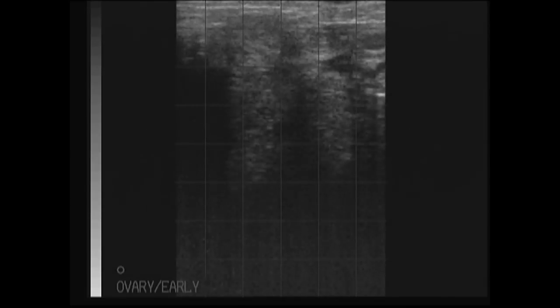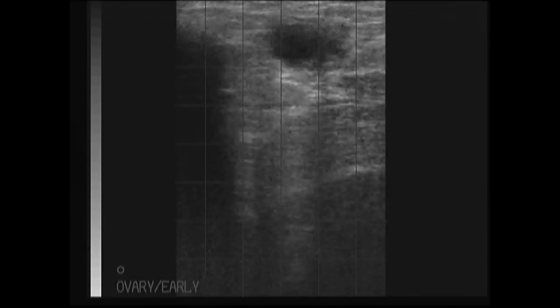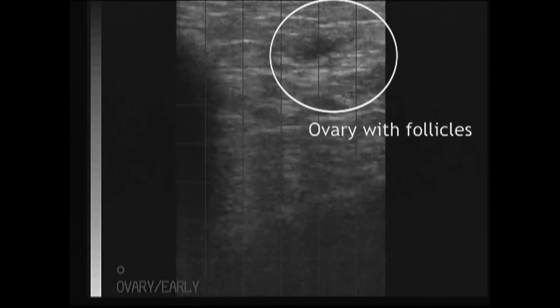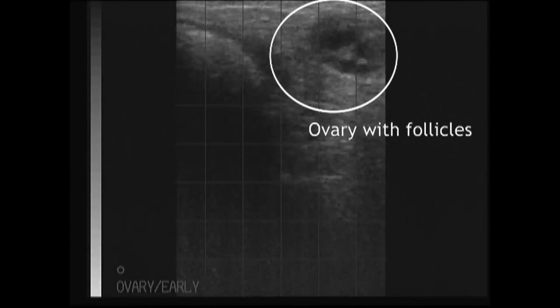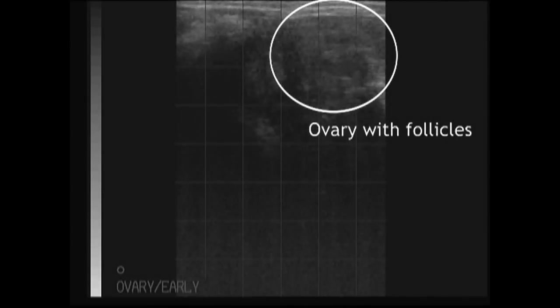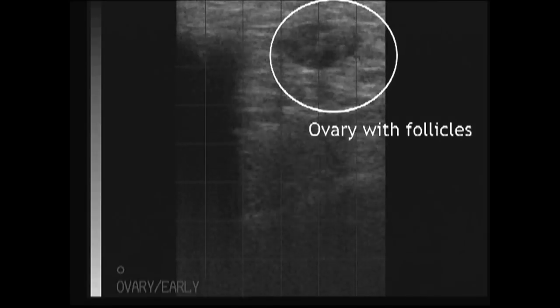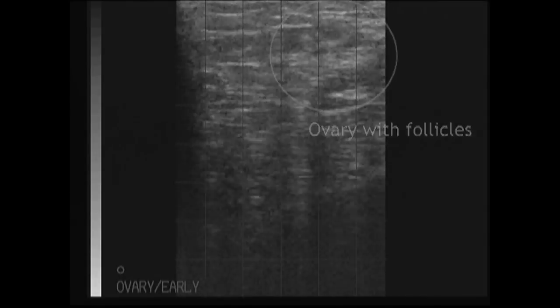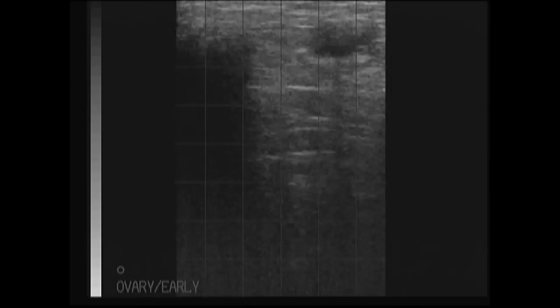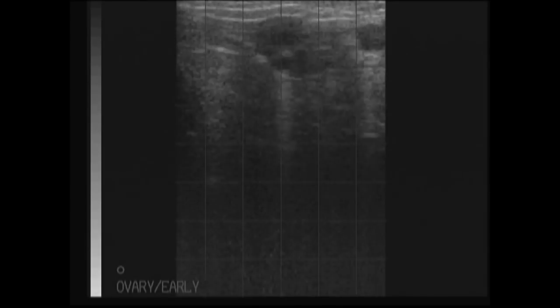We will now evaluate the ovary on this side. It is the spherical structure currently on the screen, and we can see the presence of several follicles — the black, fluid-filled objects visible on the screen.